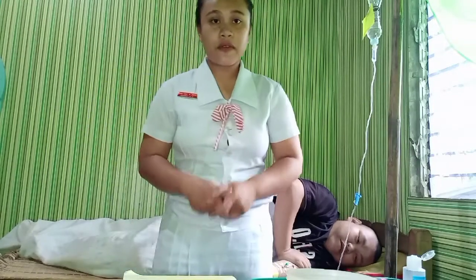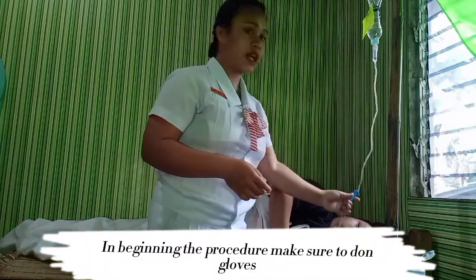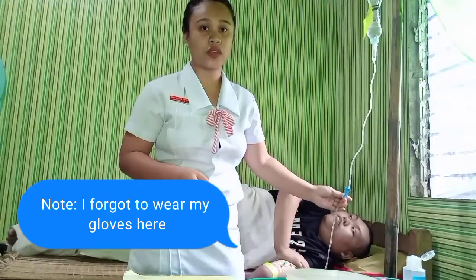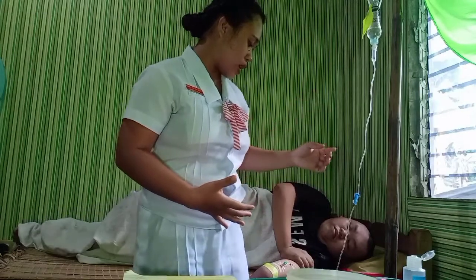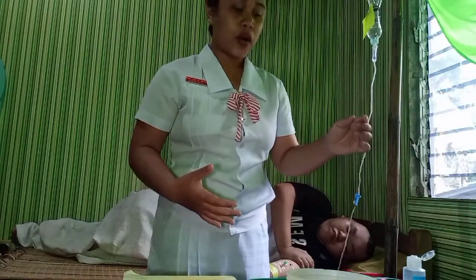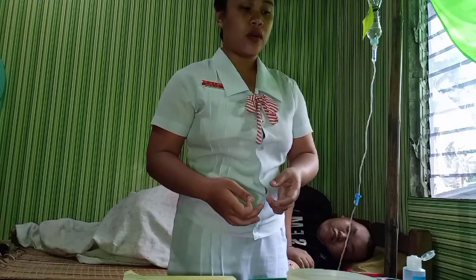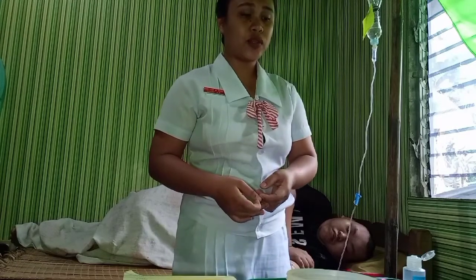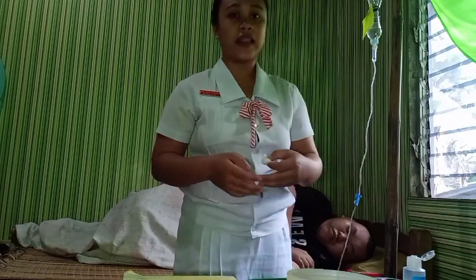Okay. If he approves and is okay with discontinuing the IV therapy, you can now proceed to closing the regulator to stop the flow to the vein of the patient. And afterwards, we need to get an alcohol and a cotton ball, or simply the alcohol swab, to wipe the part of the patient which has the plaster.